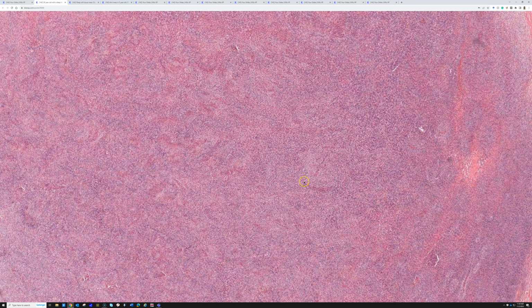So these tumors, sclerosing epithelioid fibrosarcoma, tend to have gene rearrangement of the Ewing's gene, EWSR1, usually fused with CREB3L1. The CREB genes are also involved in low-grade fibromyxoid sarcoma, but the majority of low-grade fibromyxoid sarcomas have the FUS gene fused with CREB3L2. So there is some similarity, but also some difference there.